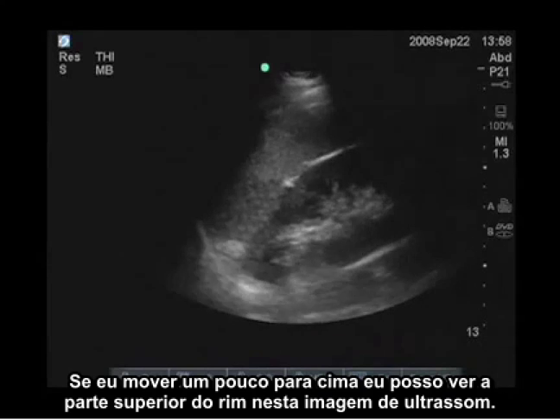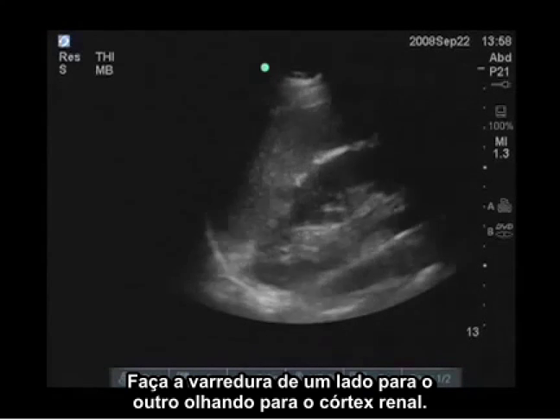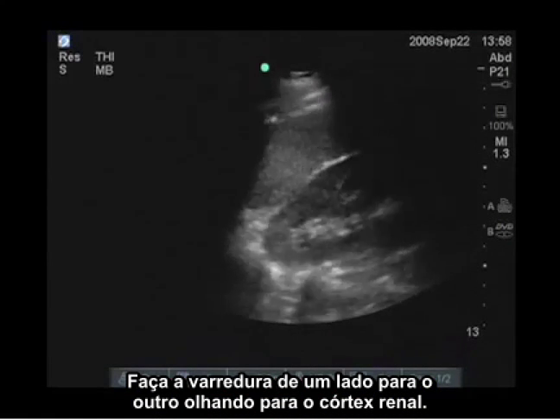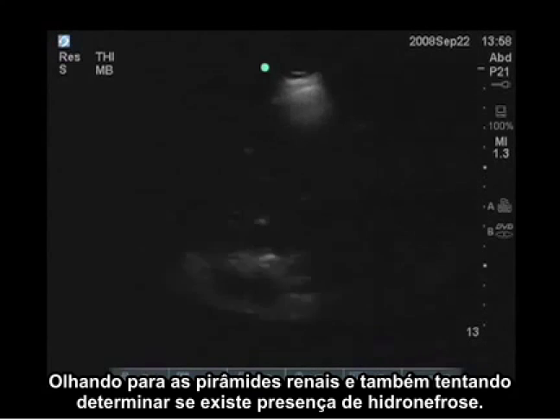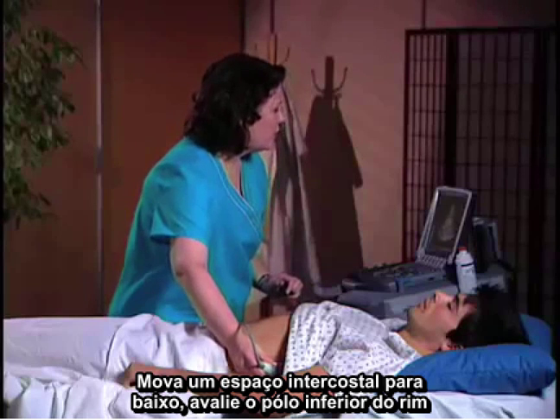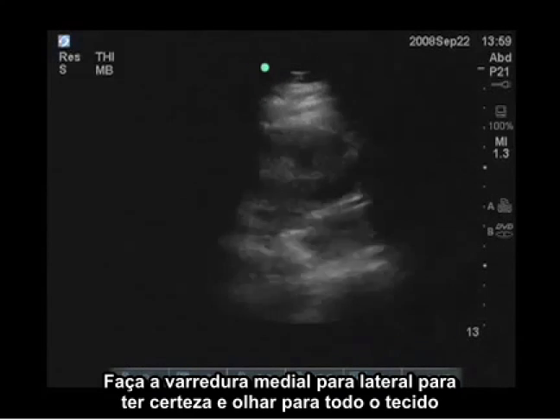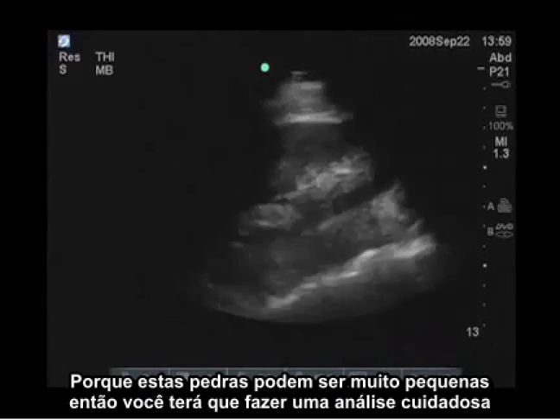If I move up a little bit, I can see the superior part of the kidney on this ultrasound image, and I'll sweep from side to side, again looking at the cortex of the kidney, looking at the renal pyramids, and trying to determine if there is hydronephrosis present. Then I'm going to move down one rib space, evaluate the lower pole of the kidney, and sweep medial to lateral to make sure I've looked at all of the tissue, because these stones can be quite small, so you have to do a very thorough evaluation.